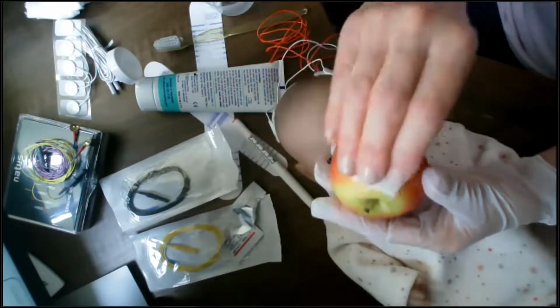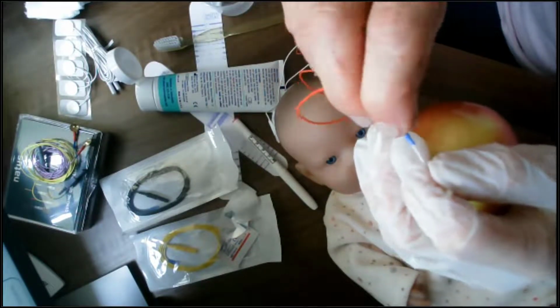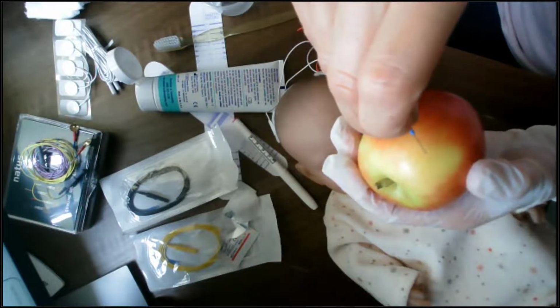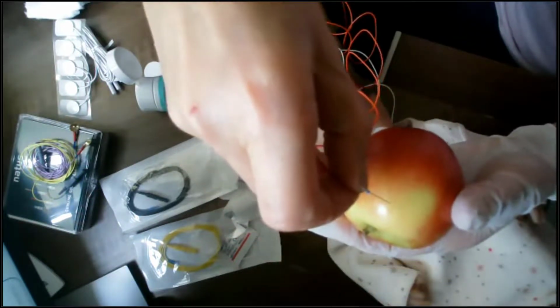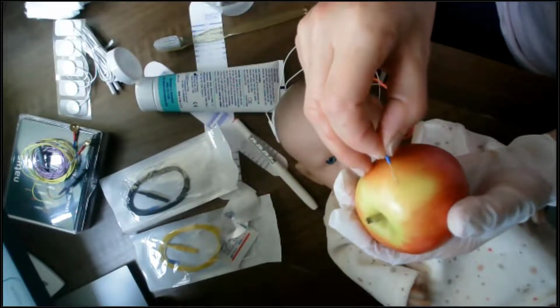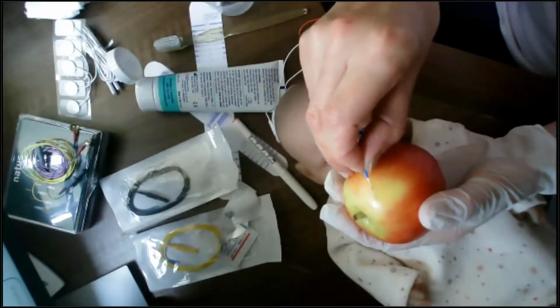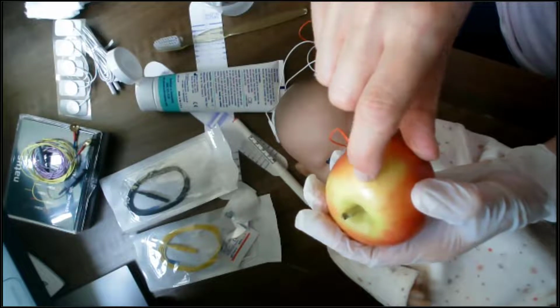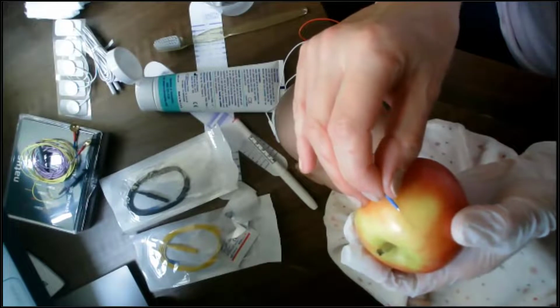Let's choose a place where I think you'll see the needle. I'll clean the baby's skin. I will take off my protective sheath. And then what I generally do is go in, I'm trying to do this at the right angle for you on the camera. I go in at a 45-degree angle until I've just pierced the skin. Then I flatten, and then I place the needle all the way in to the hub. Okay, so you can actually see that needle under the skin. It is in the skin, it's under the skin, but it's in all the way up to the hub.